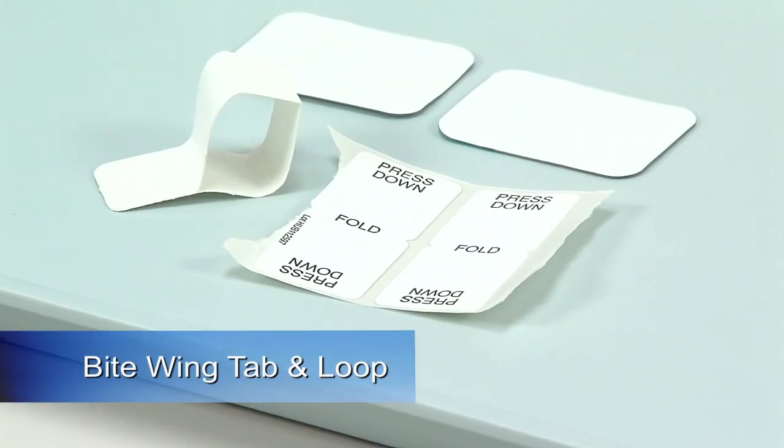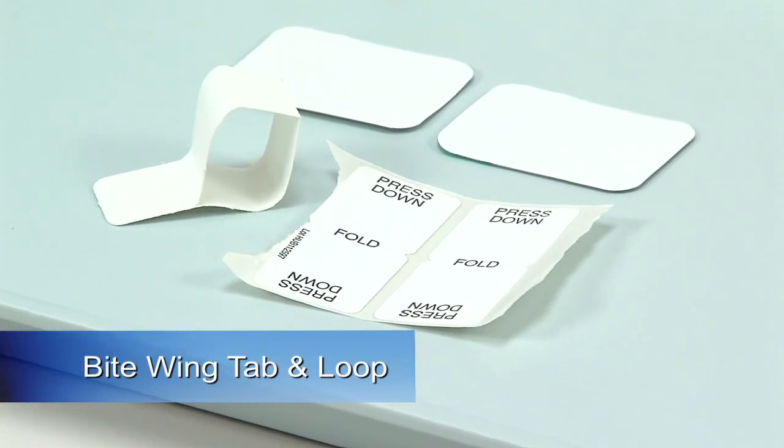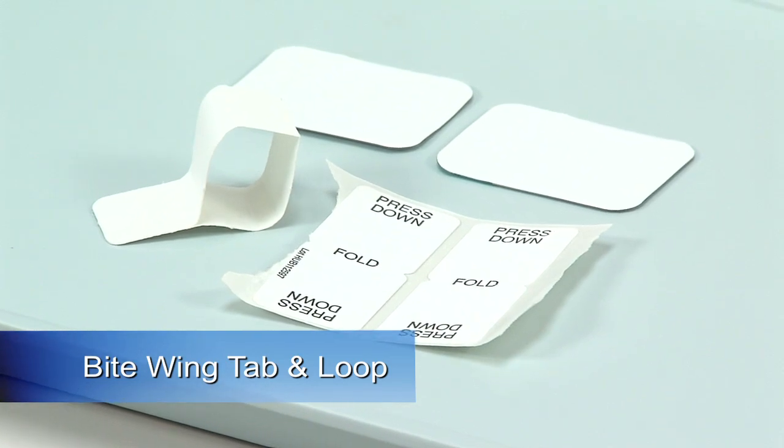Two common types of film holders specific to the bite wing projection are the bite wing tab and the bite wing loop.